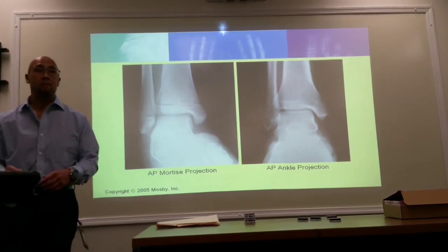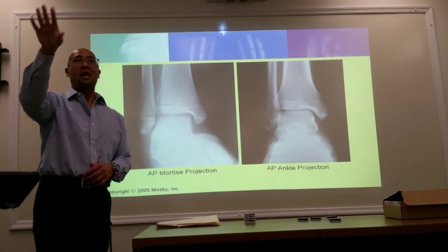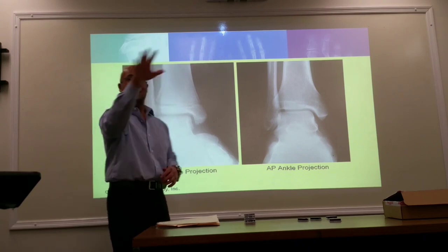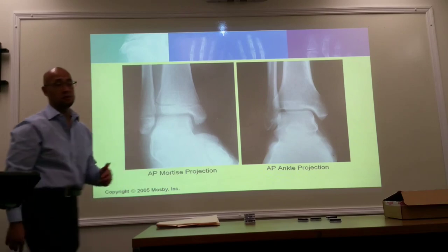Are the toes still up for that one? The toes are going to be relaxed, and then turn medially. I apologize about my hands. We'll cover that again on the positioning part of it.